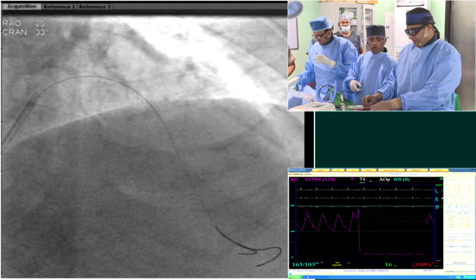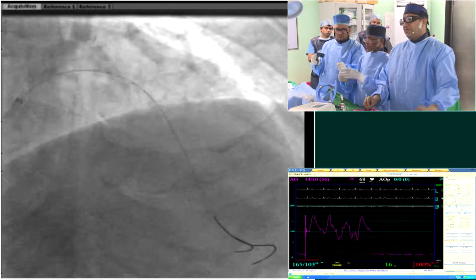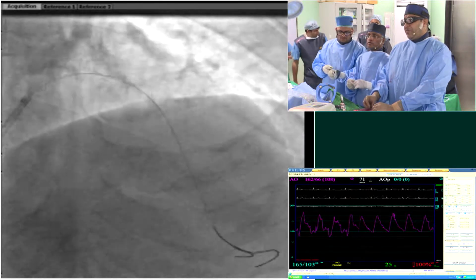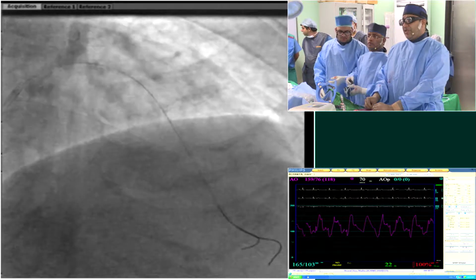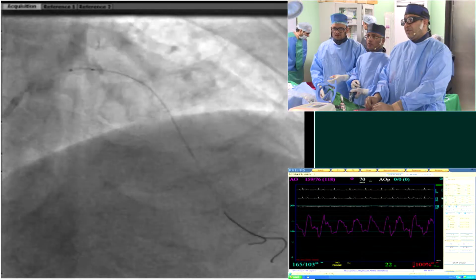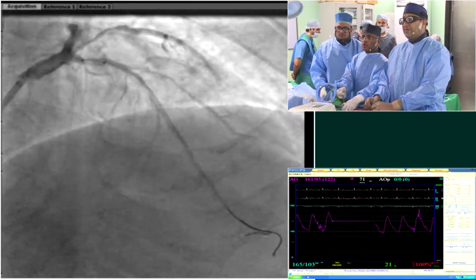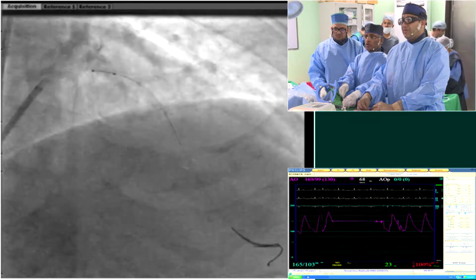We'll be taking out one wire. Do you all take a wire out when you're doing a Flextome? What is your preferred approach to bifurcation? Generally, it depends. If it is not a large diagonal, not a very ostial disease, then obviously provisional is the best approach. Otherwise, it would be DK crush versus mini crush. Do you remove the wire when you do the Flextome, or do you keep it there? There are 2 wires now. One would move it back. I would worry about wire fracture. Okay, okay.